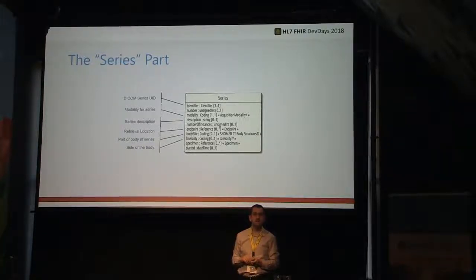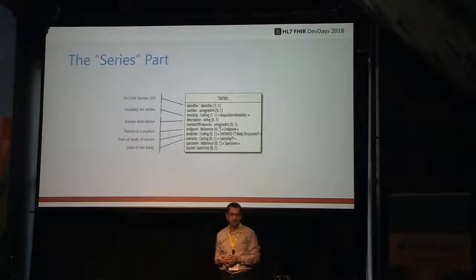In digital pathology, where DICOM is not yet so much used, a lot of times it happens that you don't have DICOM at all. You're storing images natively in a different format. So in this case, would it be okay to just have an endpoint that launches the viewer and store all the metadata in FHIR, but not have actually anything DICOM? I think yes, but I don't actually have very much experience with that yet.